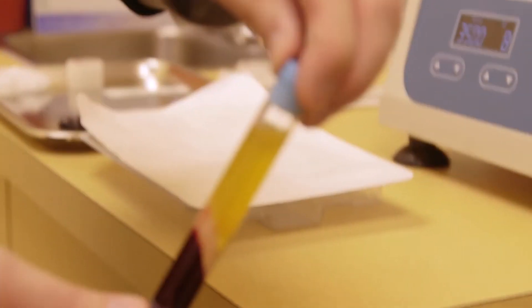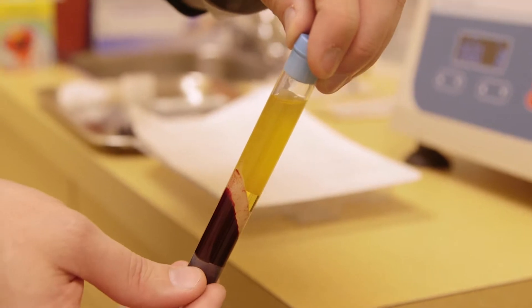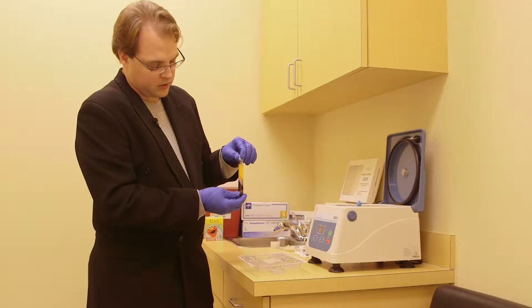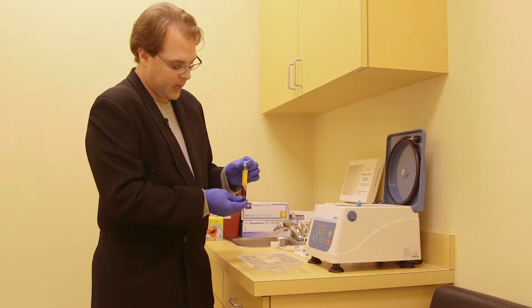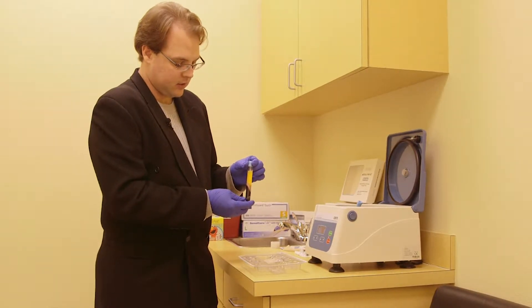Just for fun, because this showed up in this sample — if you look on the top, that's cholesterol. This is being used in an orthopedic injection for a knee, so we're going to want to capture both the platelet-rich and the platelet-poor for injection into the upcoming patient.